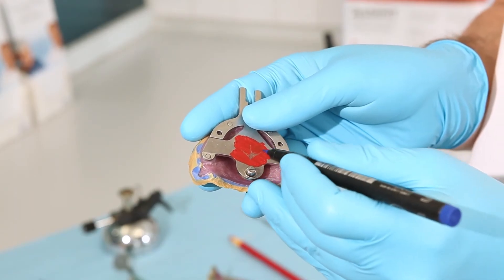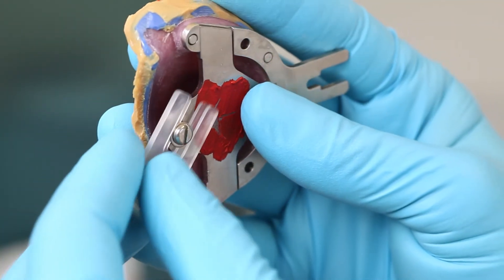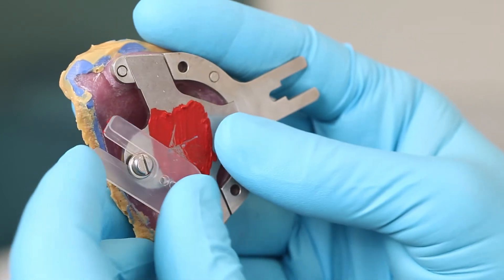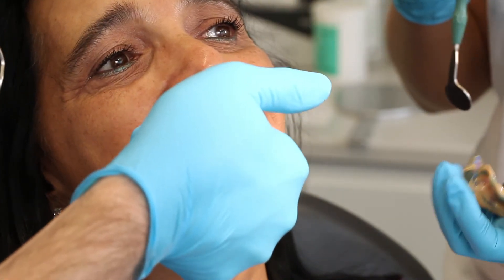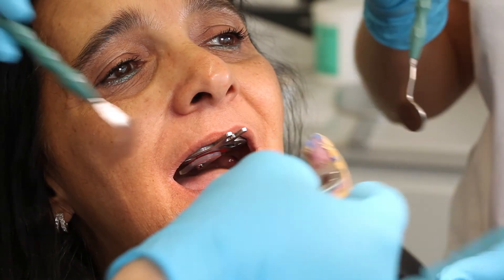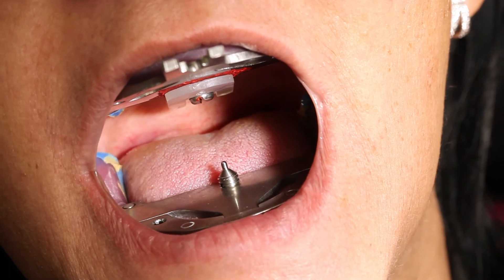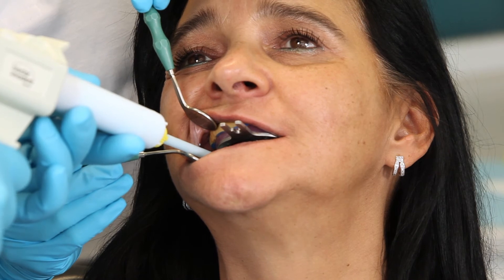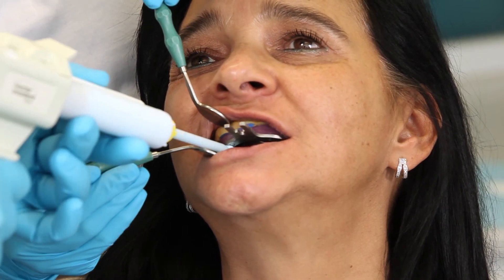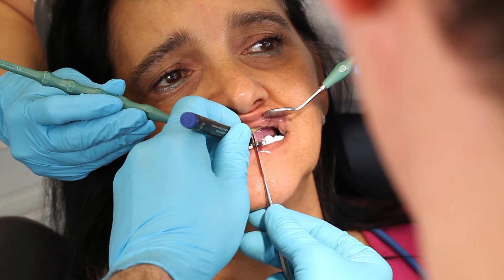Mark the tip of the arrow with a permanent marker and record the position with the perforated plexiglass plate. In order to verify this position, ask the patient to find the centric position herself several times in a row. Subsequently, this situation is recorded with virtual CAD-byte. You can now mark the midline and, if necessary, other referencing lines for the dental technician.